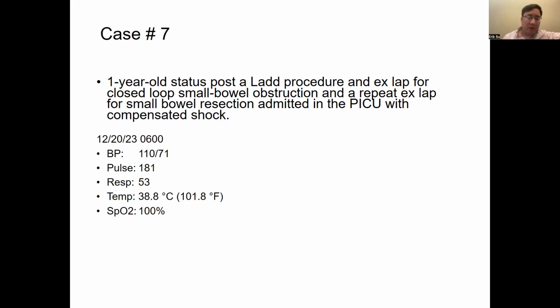It tends to be one of the things that people do most when they start out, like our hospitalists are doing mostly lung ultrasound stuff right now. I mean, I think your approach is really interesting.